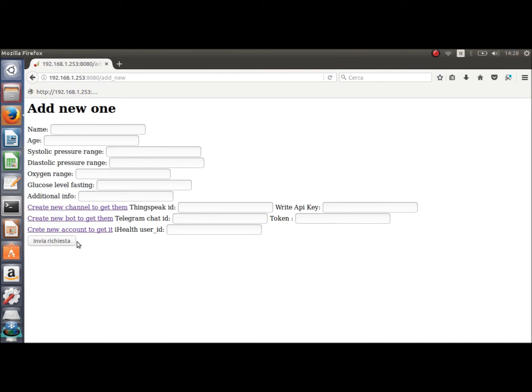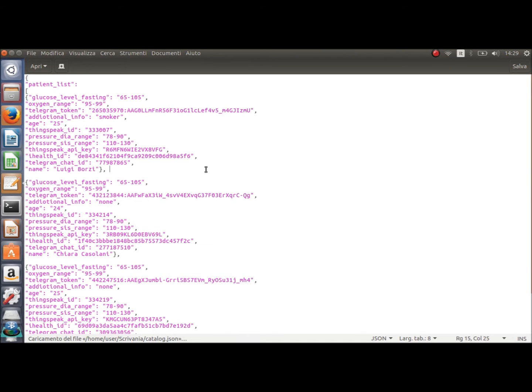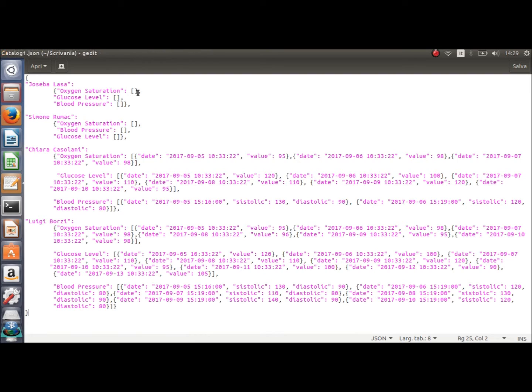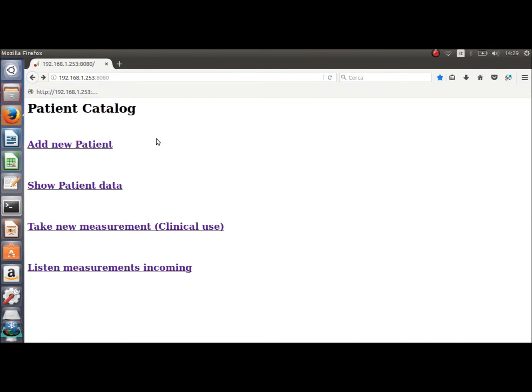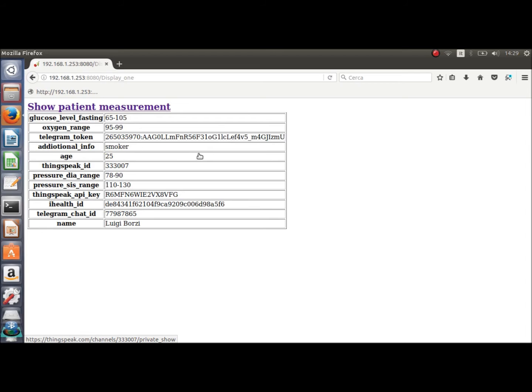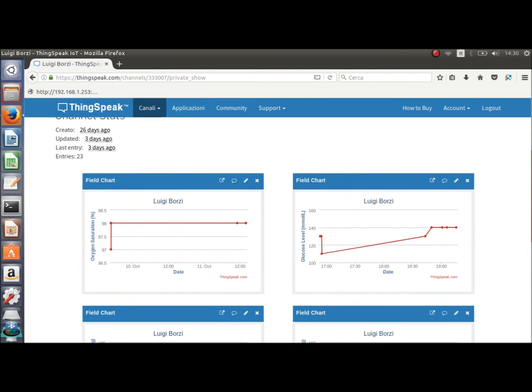When the form is submitted, the program will save all this data in a JSON database, which contains all patients' info. It also creates new lists in the JSON measurements database under the new patient's name, ready to receive new data. Now we can move to another service, which is Show Patient Data. We click on it and write down the patient name. The program will show patient data, and also the right ThingSpeak channel is opened, showing the parameters' measurements plot.